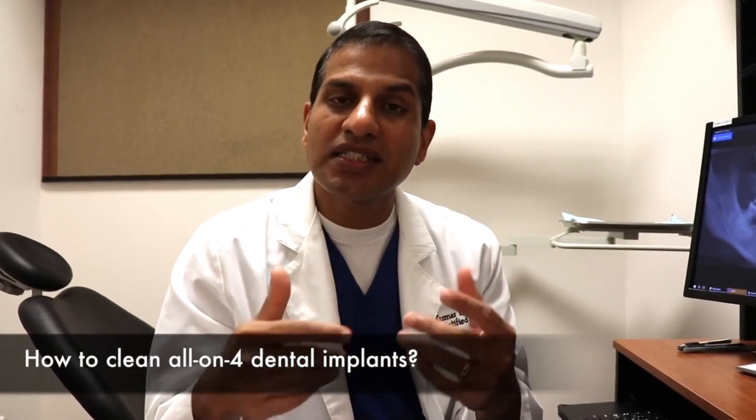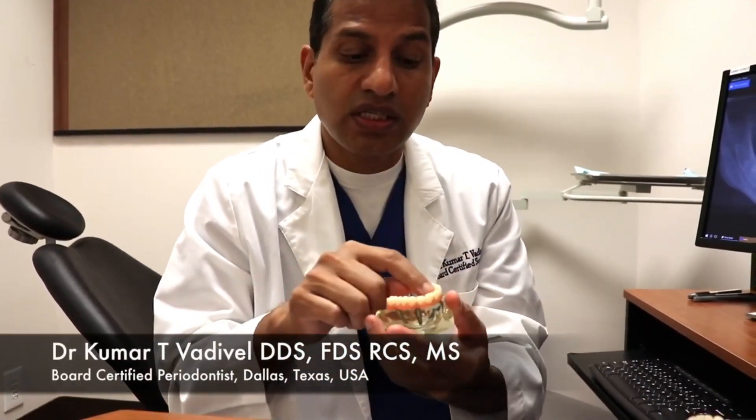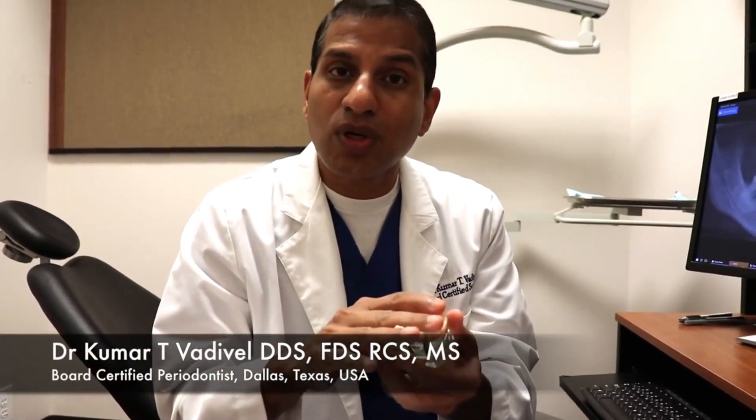When you come to us, in addition to helping you choose the right oral hygiene aids, we are also going to do a professional cleaning around the gum line — and depending on the condition, sometimes we even take out the teeth using the little attachments on the implants.